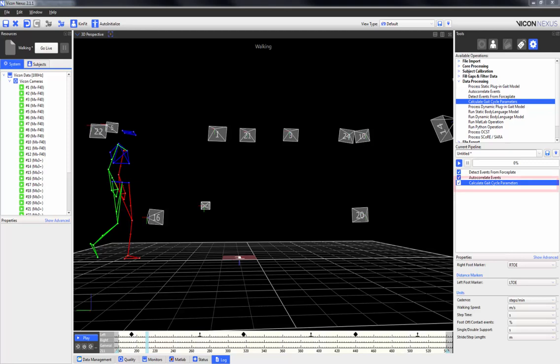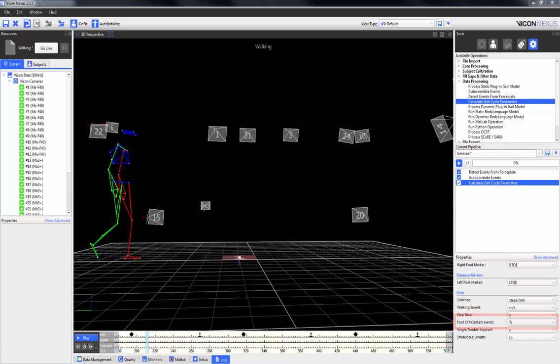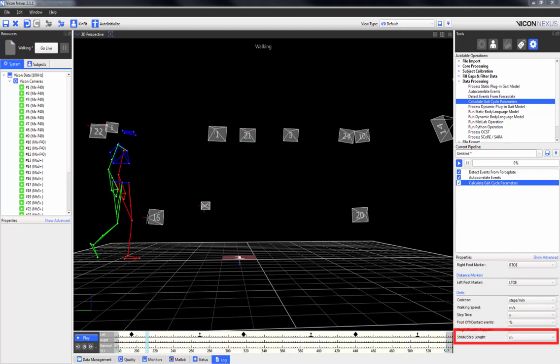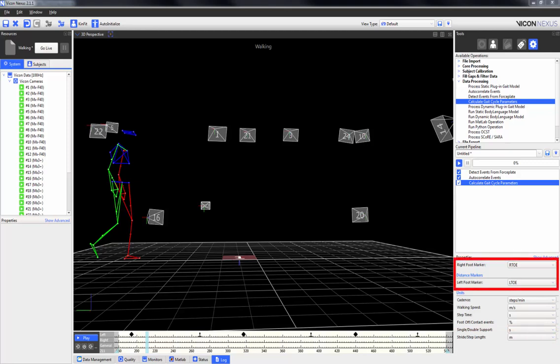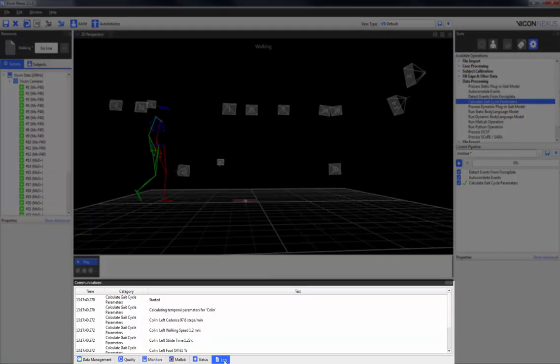Once gait cycle events have been placed in the time bar, the Calculate Gait Cycle Parameters pipeline operation can be used to calculate the cadence, the walking speed, the step time, the foot off and contact events, the single or double support, and the stride and step length parameters. All of these parameters can have their units adjusted, and the left and right markers can also be selected. Once the operation has been run, you can find the parameters in the log window.